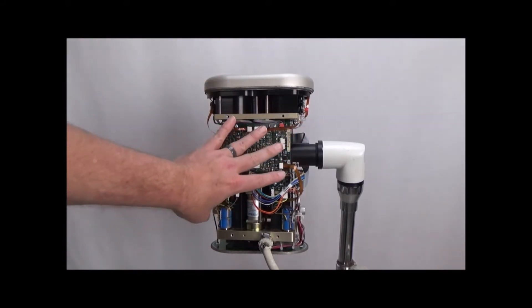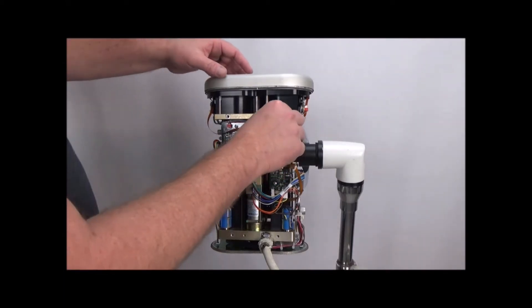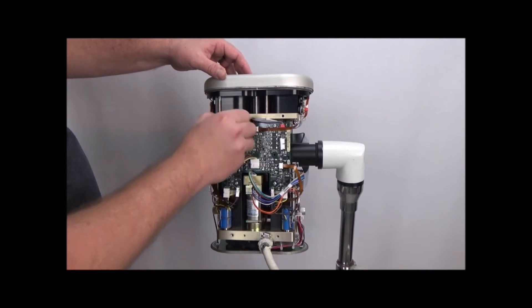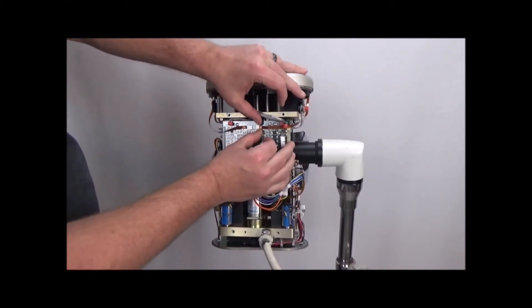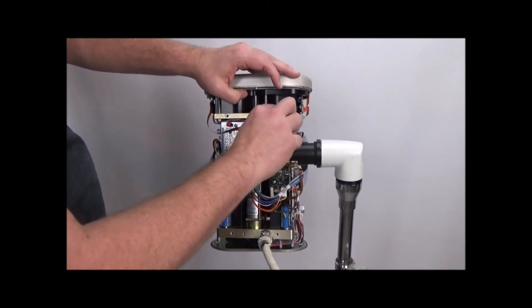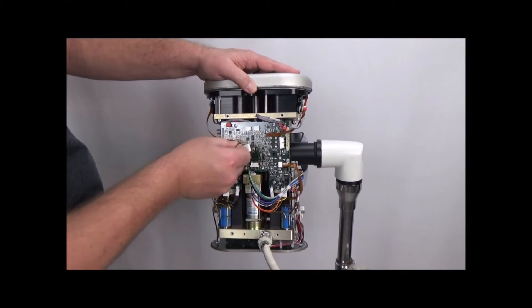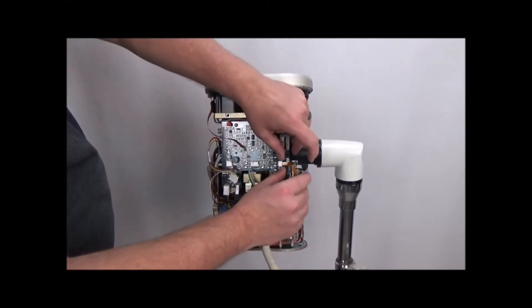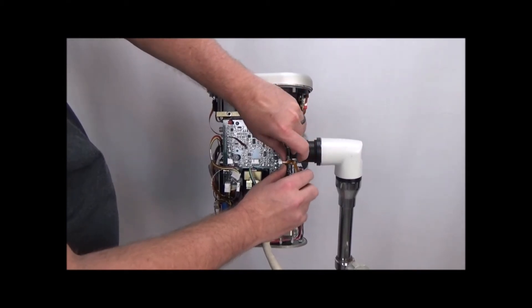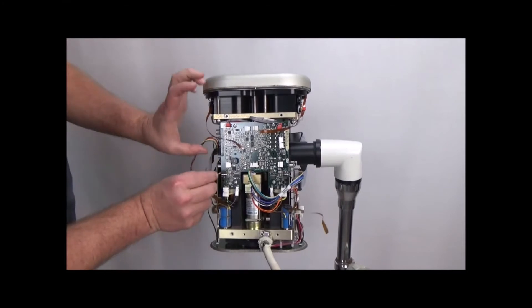The first thing we're going to do is remove the interface board. There are 13 different connectors you have to disconnect. We'll start with those — pull these out, slide these out, and work through this connector here.